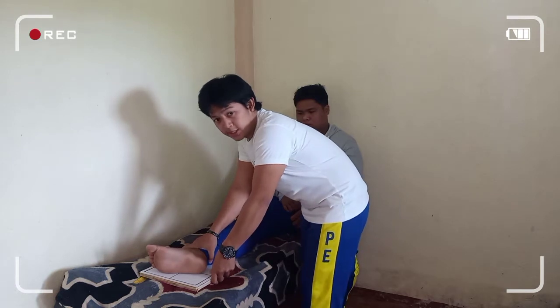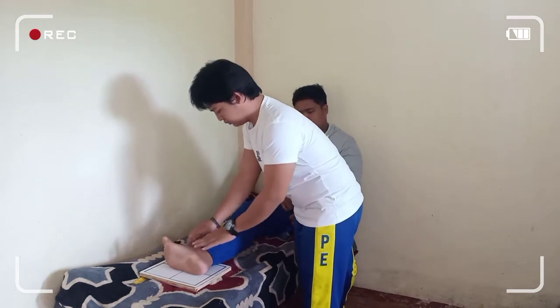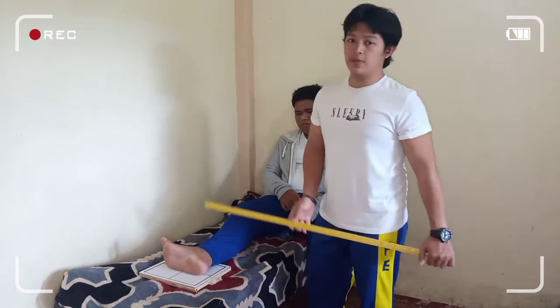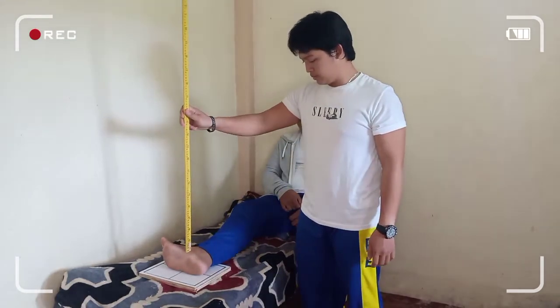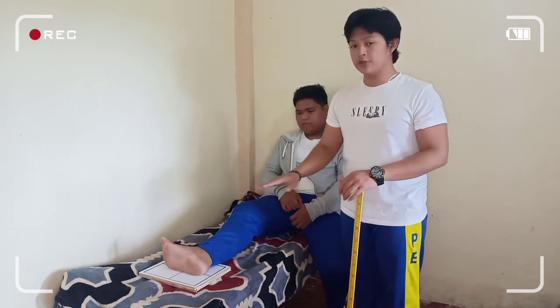Dorsiflex the foot to 90 degrees, and the central ray must be perpendicularly directed to the midfoot. The structures shown in this projection are the entire foot and the distal end of the tibia and fibula.